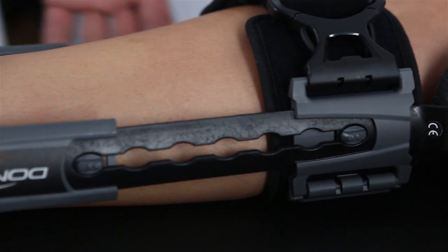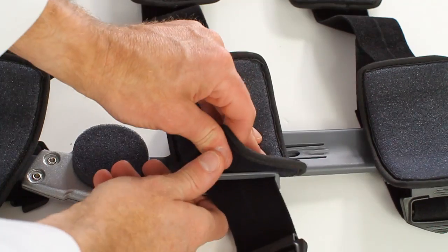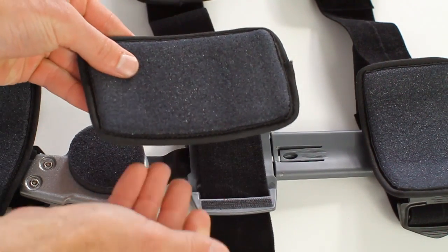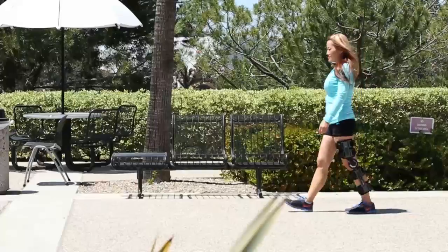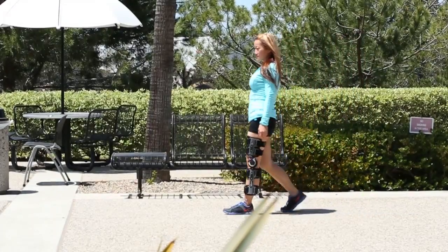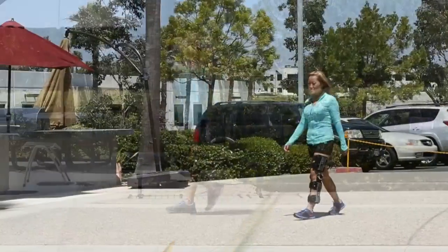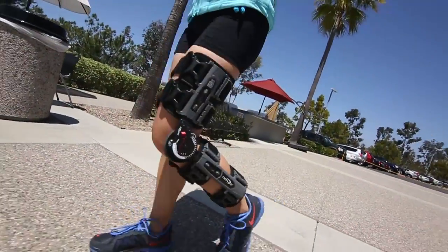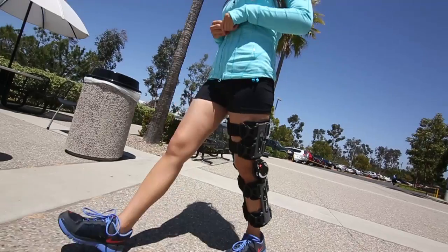If the padding is dirty, let your patient know that it may be removed, hand-washed, and air-dried. The DonJoy Exact ROM is an excellent brace for post-operative knee patients. It's lightweight, durable, and provides patients with the comfort, support, and range of motion they need during the recovery process.